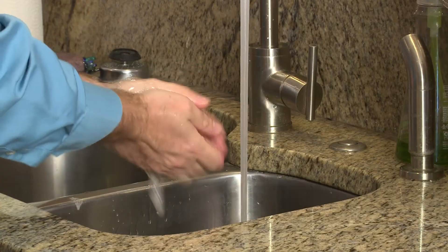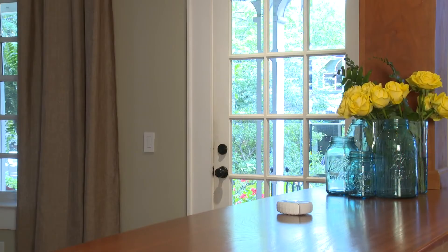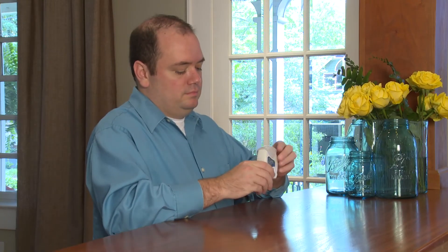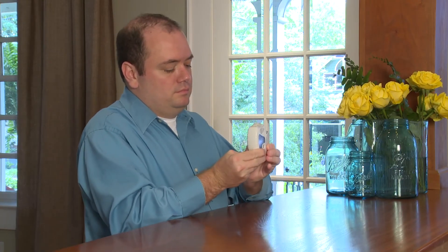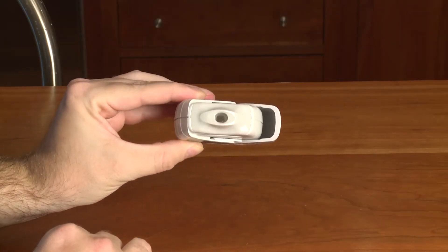It is important to wash your hands with warm soapy water and then dry them completely before using your Ellipta. The first step to using your Ellipta is to open it. Hold the outer case and slide the cover down until it clicks in place. When the Ellipta is open, you can see the mouthpiece.